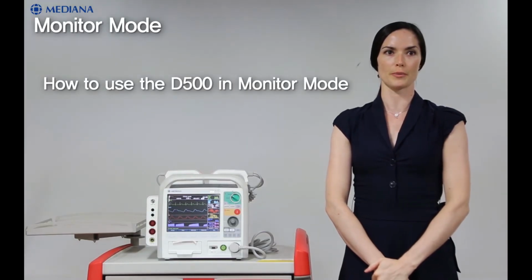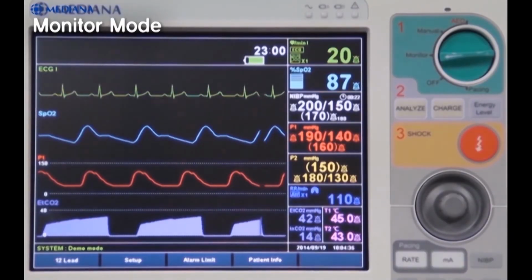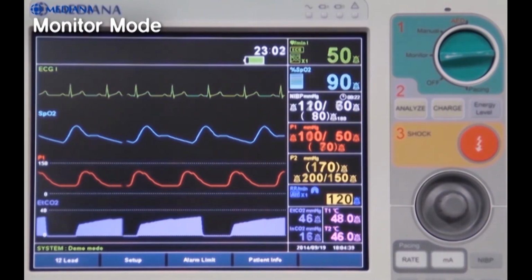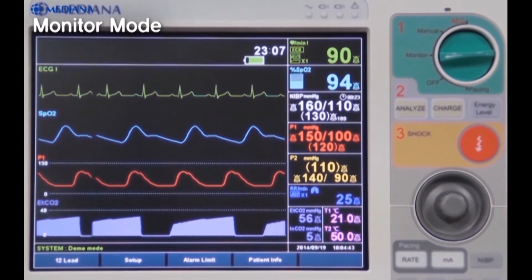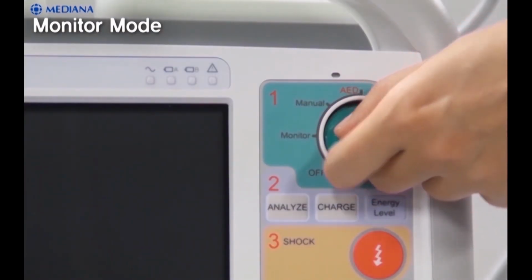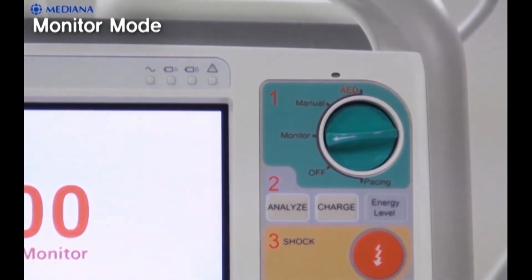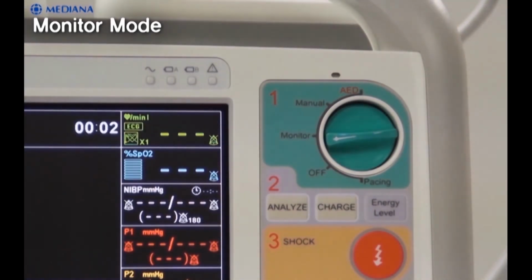Monitoring mode. Now, let's see how to use the monitor mode. The D500 manual defibrillator provides the monitor mode to view the ECG waveform, the heart rate, pulse rate display, NIBP, SpO2, respiration, temperature, IBP, and capnography monitoring. If you want to use the monitor mode, turn on the monitor mode by rotating the mode select knob after connecting the accessories. Then, verify that the monitor mode is activated normally.